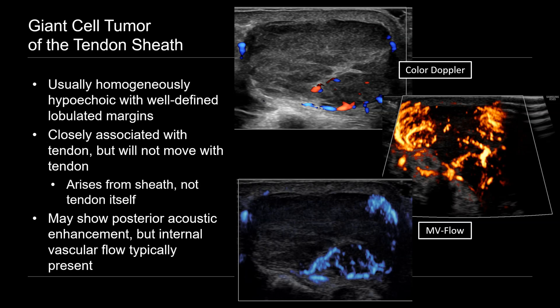They may also show posterior acoustic enhancement — as in this case we see these bright echoes posterior to the mass, this increased through transmission. That's something that may make you initially think, could this be a complex cyst? But the presence of internal vascular flow will allow you to confidently diagnose this as a solid mass.